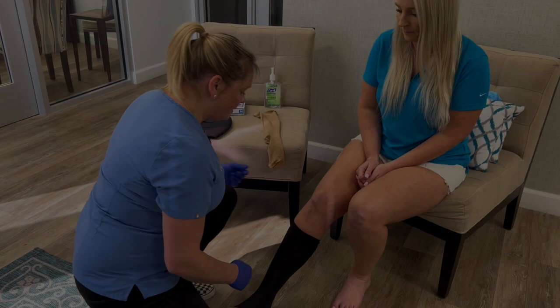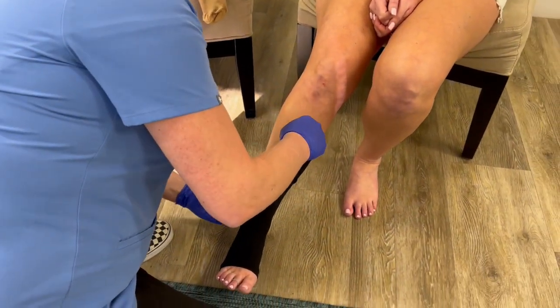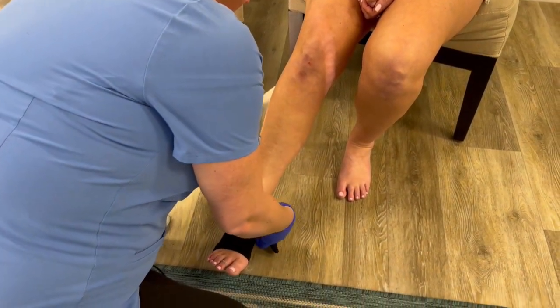Taking the zipper off is a bit easier — you're going to gently, slowly unzip and then it's going to come off much easier.